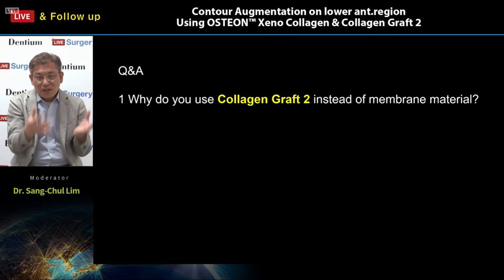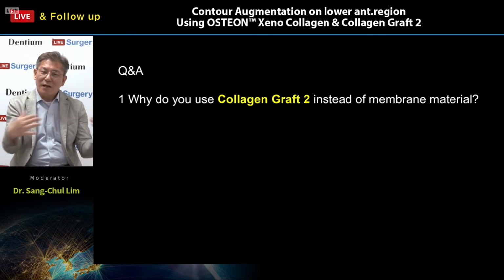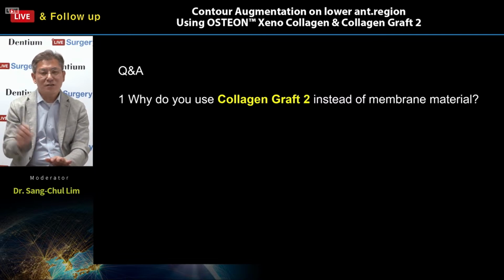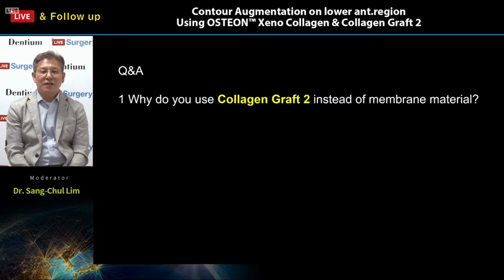This one promotes and accelerates blood supply and soft tissue healing. The membrane basically blocks the blood supply, right? Two different ways.